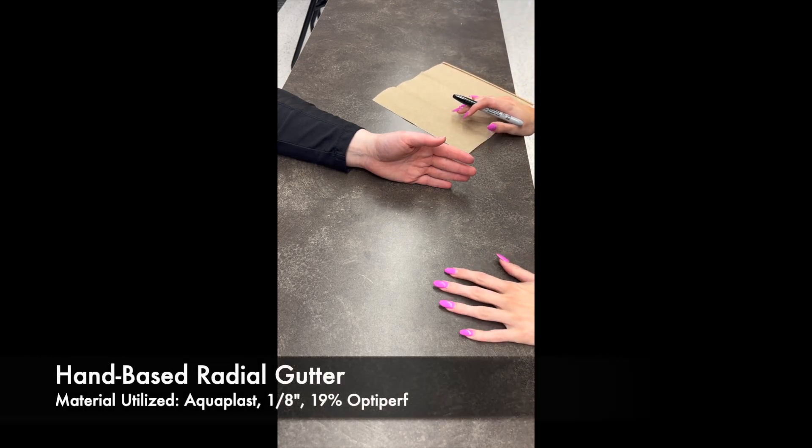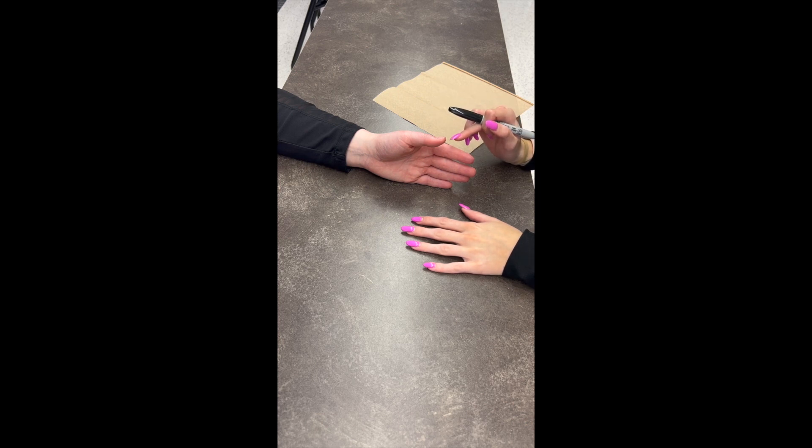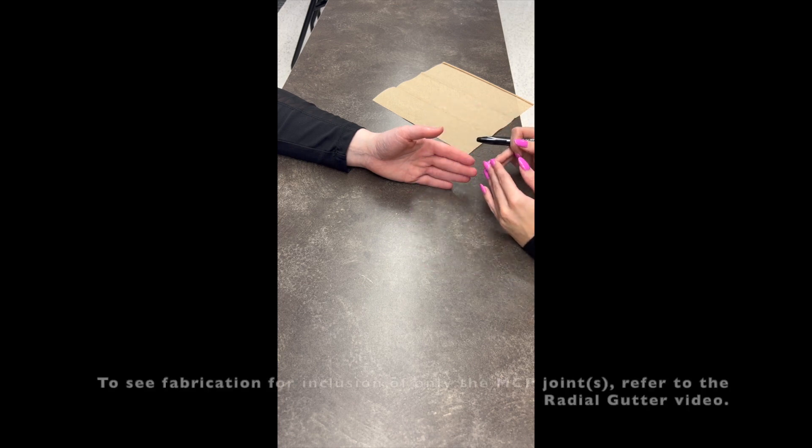We are going to be fabricating a hand-based radial gutter. This orthosis can include one finger or multiple fingers, and one joint or multiple joints. Today we are going to include the index and middle finger and extend it all the way to include all the joints.